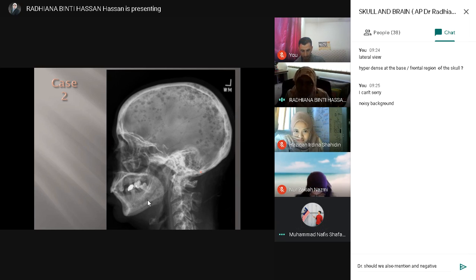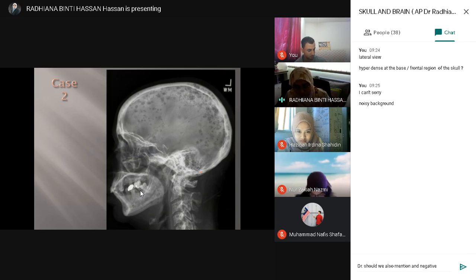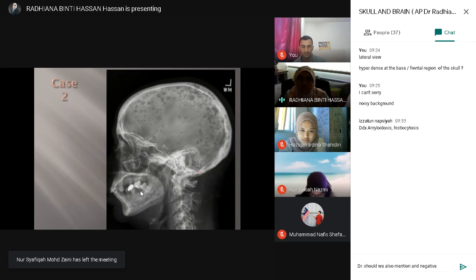Okay. So you all have done medical posting, right? Year 4? Yes. Okay. So basically this is quite a common image, so I expect you all have seen before in your clinical posting, medical or surgery. So for now, usually when you are having your radiology posting, I expect you already have some degree of knowledge or exposure towards some of the imaging.